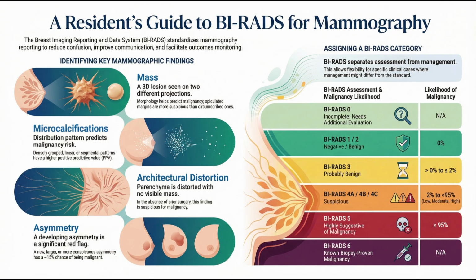70? Wow. It's amazing that a microscopic difference in shape, a branching line versus an irregular dot, can jump the risk from 29% to 70%. It really is. It shows that when cancer starts in a duct and uses that network to spread, the likelihood of it being malignant is just so much higher.